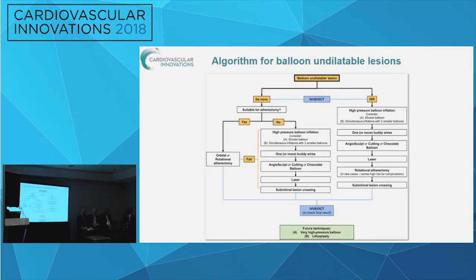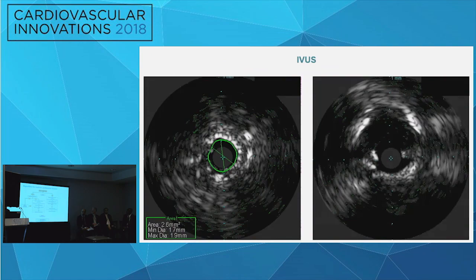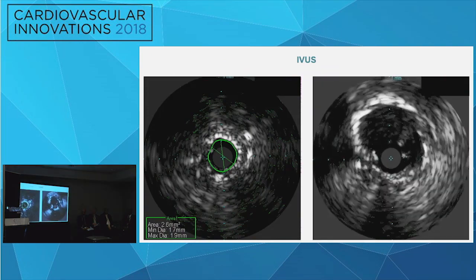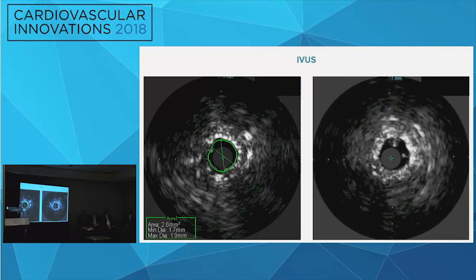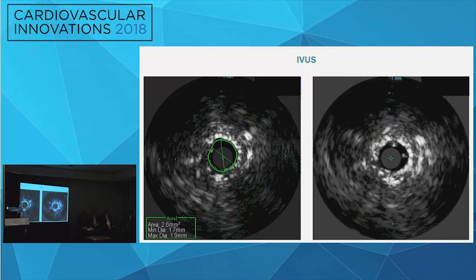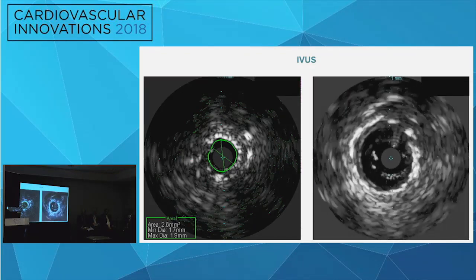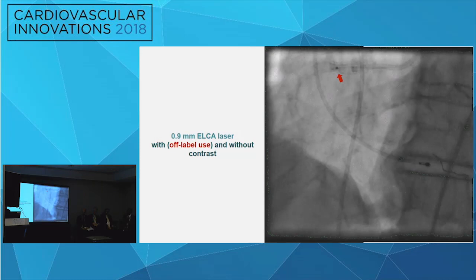We recognized that we faced a balloon undilatable lesion, and this is the current algorithm we are using for treating such a phenomenon. Initially, we performed intravascular ultrasound, showing an MLA of 2.6 square millimeters.